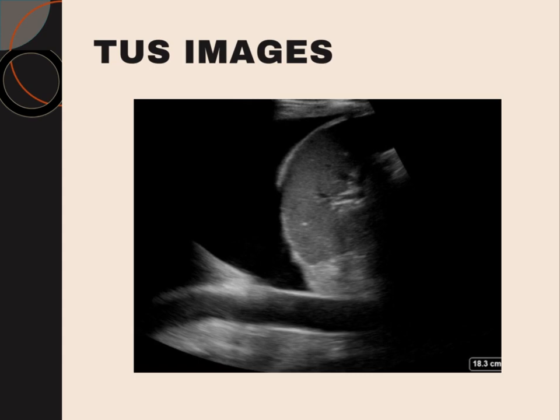This one is the diaphragm, the white rim, just above the liver with its sinusoids. Above the diaphragm is the pleural effusion. Normally, we shouldn't find this black anechoic shadowing, because of the lung tissue there, and the tissue density is just like the liver. We couldn't find any black shadowing or anechoic shadow.